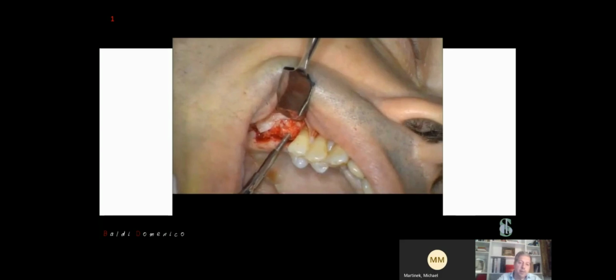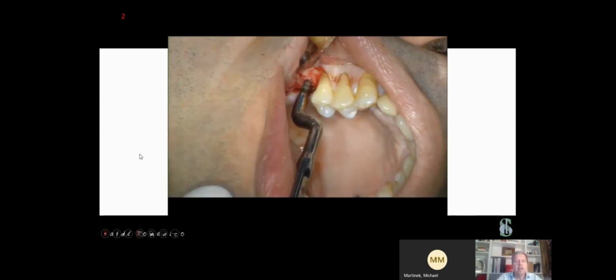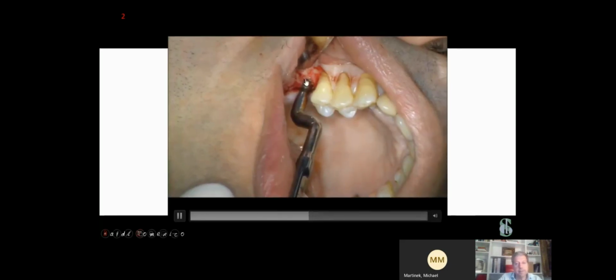Here in this video, I want to show you all of this surgery in order to be more clear during our procedure. And so you can see here how we approach this situation. With the first tips, we work in a tilted way, as I told you, and when we arrive at the right position, we start to upright the instrument in order to create a movement of the floor of the sinus, in order to move also the Schneiderian membrane. At this moment, we use a larger instrument in order to create osseodensification and an expansion of the bone. You can see here this bone.